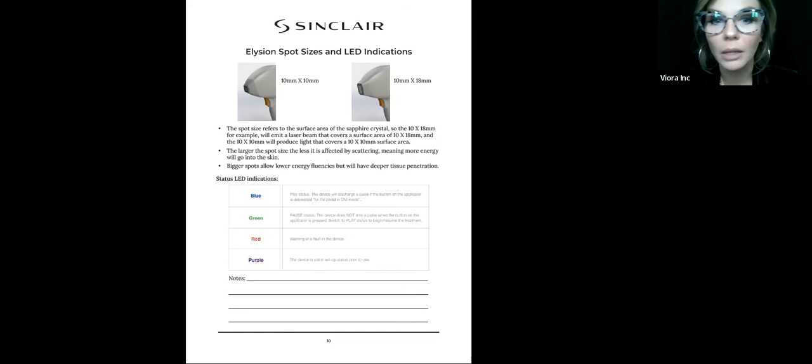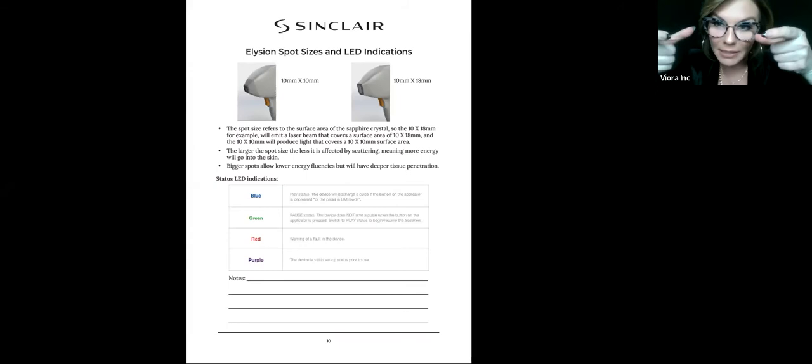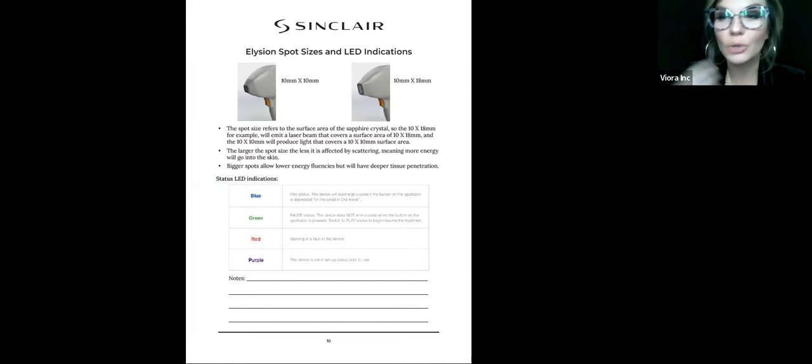Okay, the bigger the spot size, the deeper the penetration, you have just more surface area to cover, and the spot size actually goes deeper. The smaller the spot size, the more superficial you're staying in the skin. And the larger the spot size, the less scatter that you have. So you actually have more energy being absorbed into the skin. So you're actually having to use less energy with larger spot sizes.